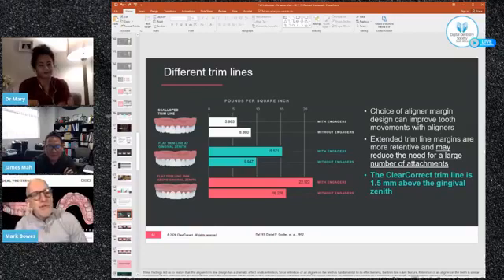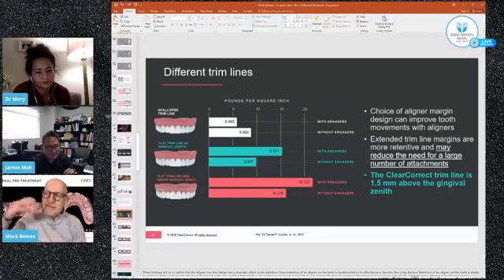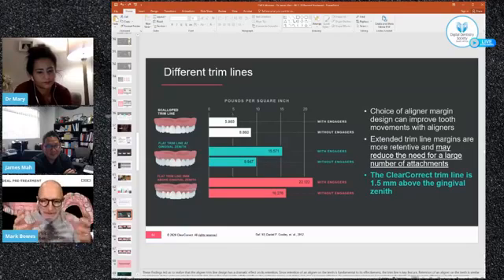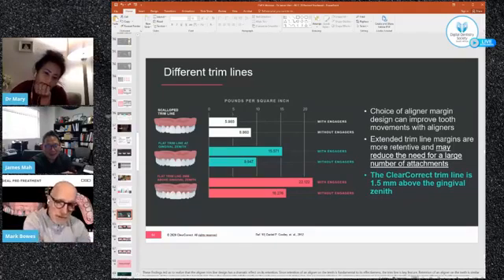But an interesting study would have been to see how accurate the attachment bonding was from one dentist to another, because obviously the accuracy of the attachment when we're bonding it to the tooth has a massive impact on the success of the case. My concern is often that the bonding procedure isn't going as it should, as the computer programmer wanted us to do. So I'd be interested to see a scan of how they were bonded and what the computer wanted. I think that's a big problem. Yeah, you're completely correct.